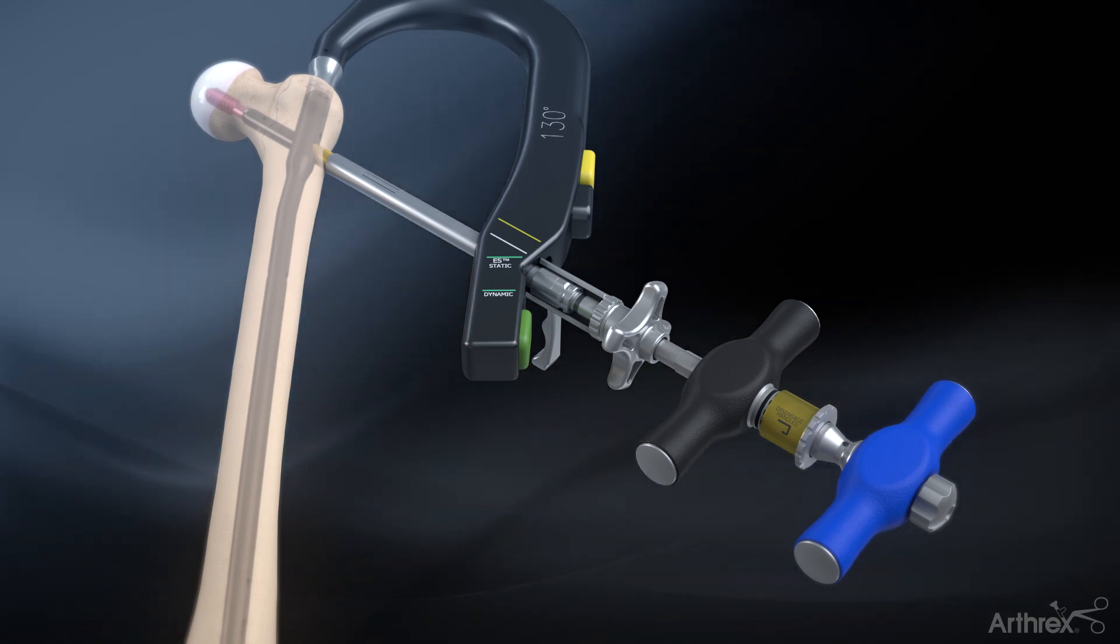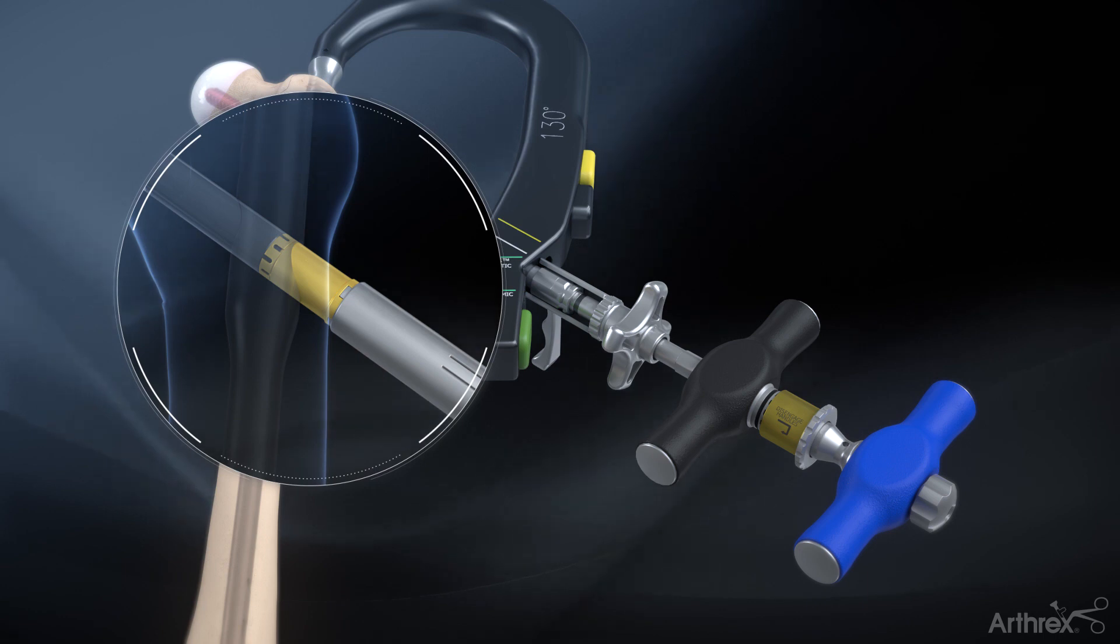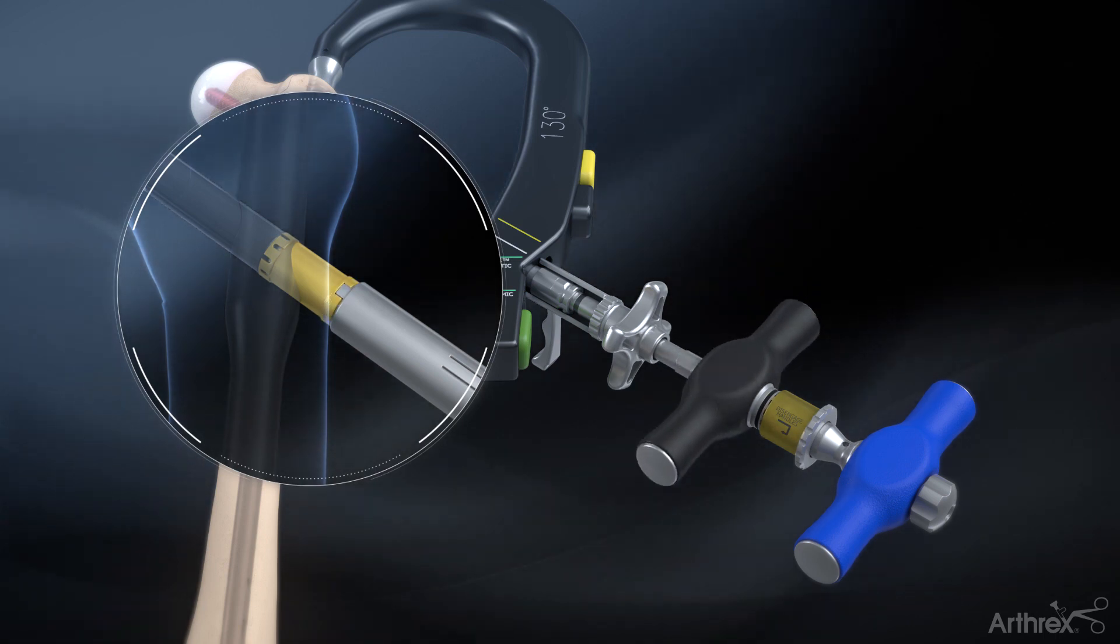To lock the telescoping lag screw, hold the blue handle stationary and turn the black handle clockwise until the torque limiter clicks.